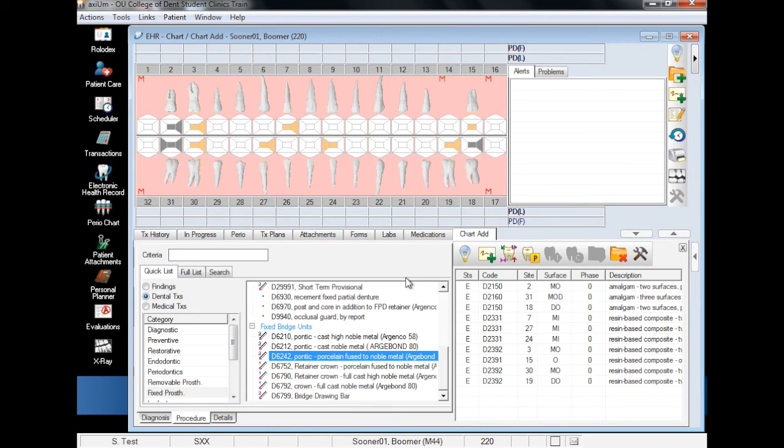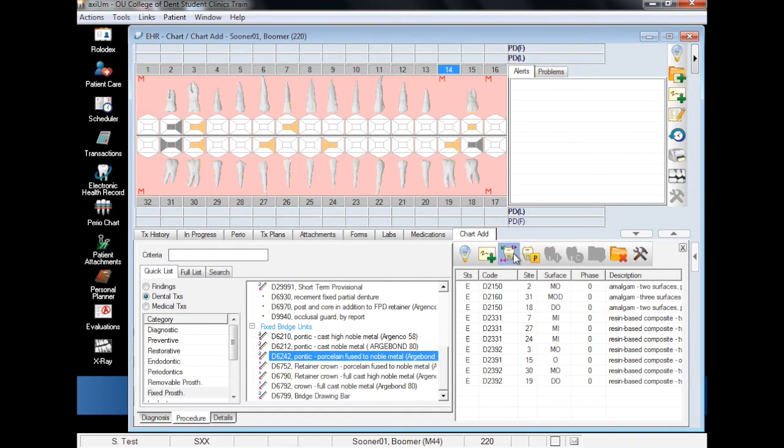As with before, select the procedure code, the tooth, and finally add finding.